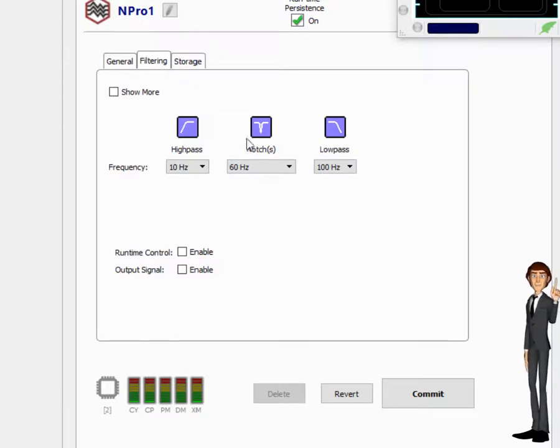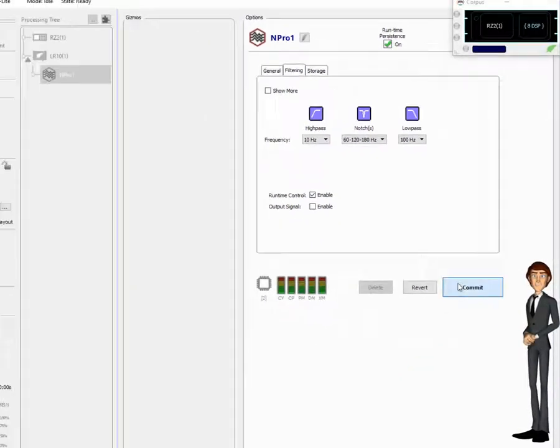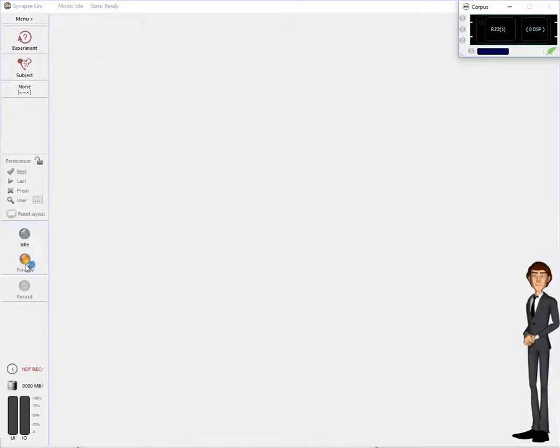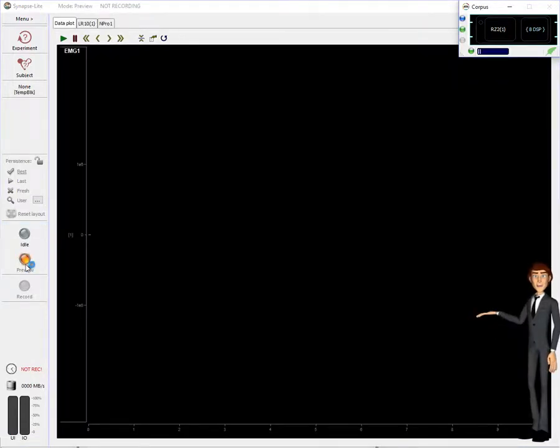Because power mains can corrupt our signal, I like to turn on notch filtering for 60Hz and its harmonics. Also, click the runtime control on, so we can adjust these filter settings while we're collecting data. Click commit to apply these changes and we're ready to record. Click the preview button to switch Synapse into runtime mode.